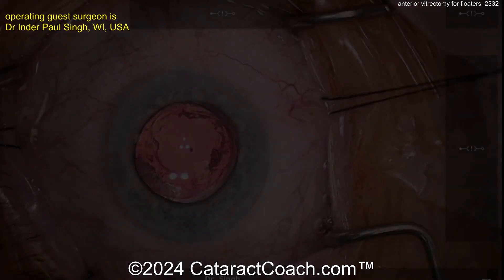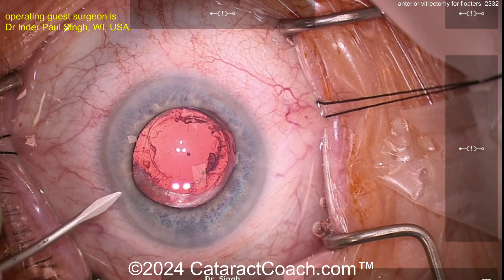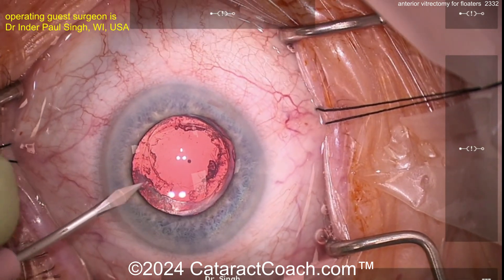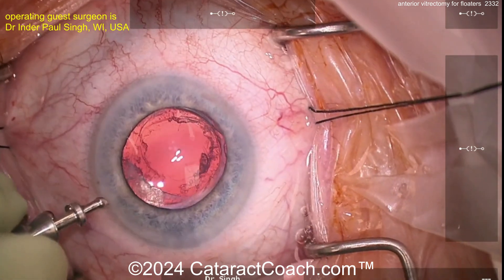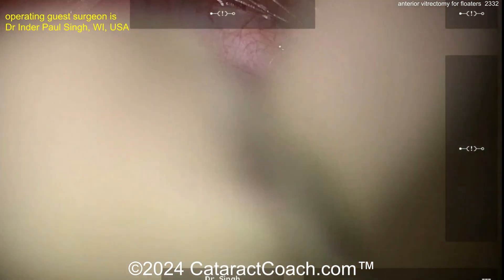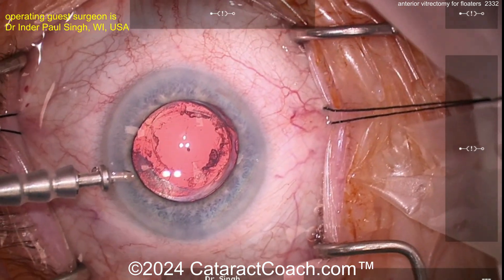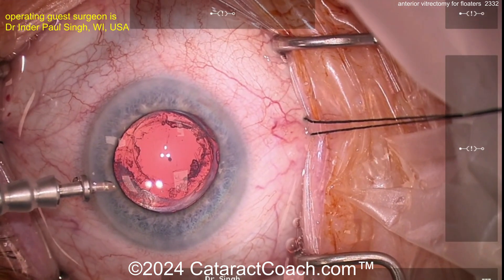Here we are making our paracentesis with our 1.0 keratome blade. I'm going to put in an AC maintainer — this is a really ergonomic, easy-to-insert AC maintainer. I'll take some tape and tape that tubing so it stays nice and stable. Now we have the AC maintainer in there keeping a nice formed eye.